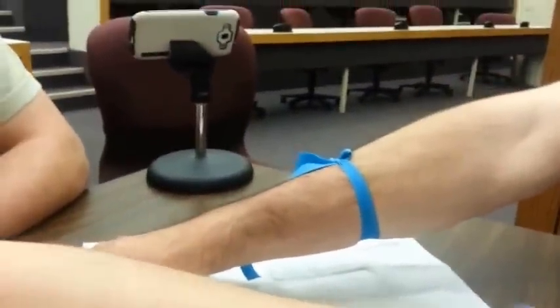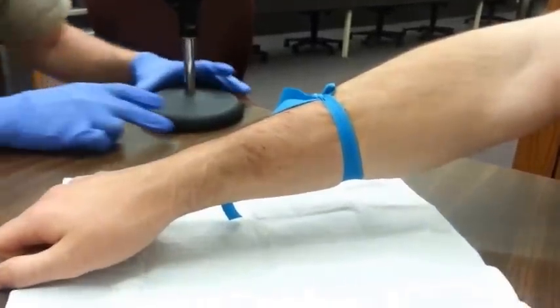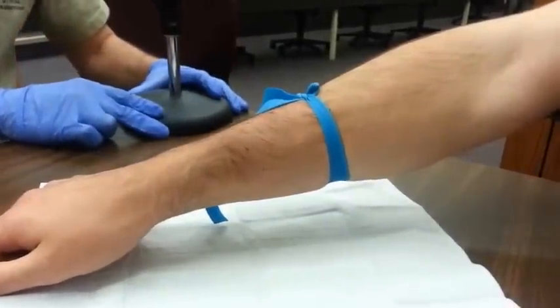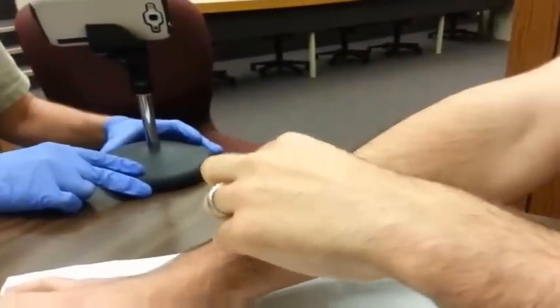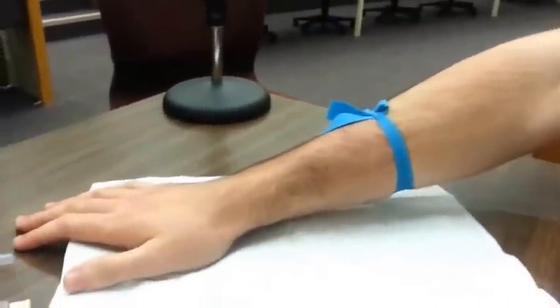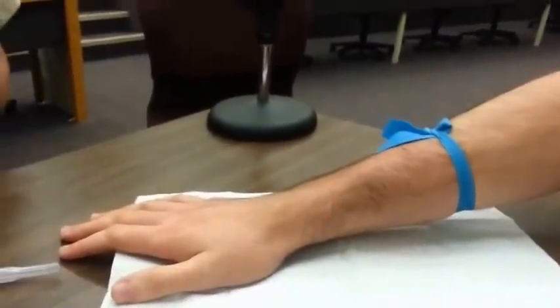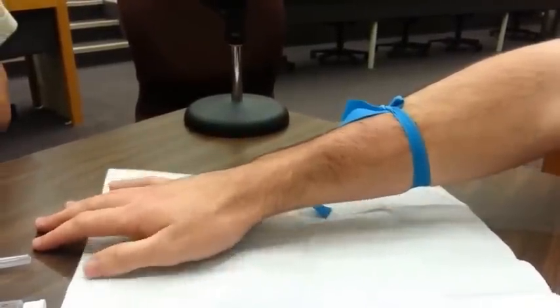There are many modifications to the tourniquet tie, but you'll want to make sure you tie it so that it can be released with one hand. We just demonstrated one version of the tie so that if you pull on either one of these ends, the tourniquet will come loose. You'll want to tie it tight enough to impede venous blood flow, but not too tight.